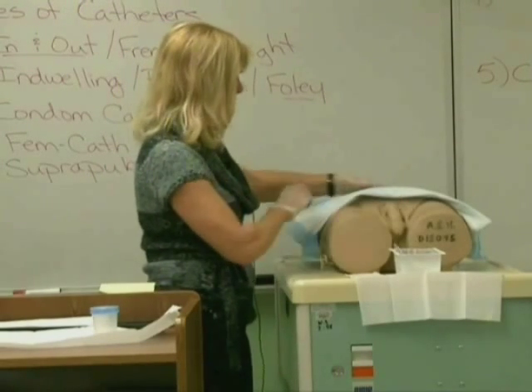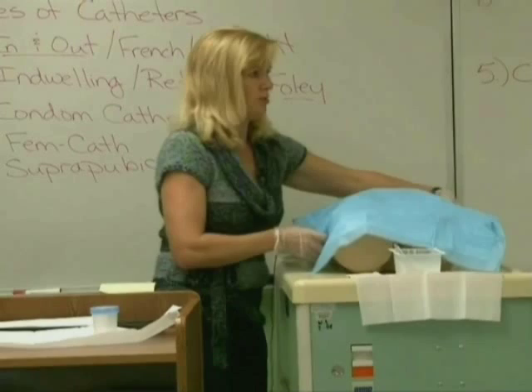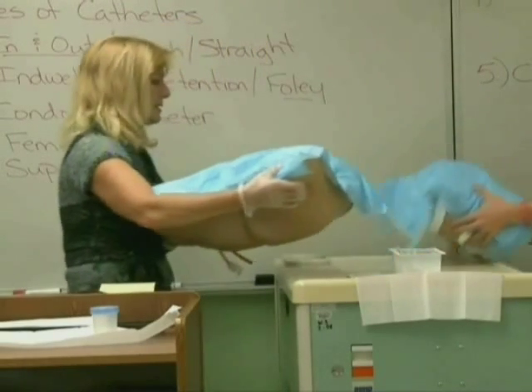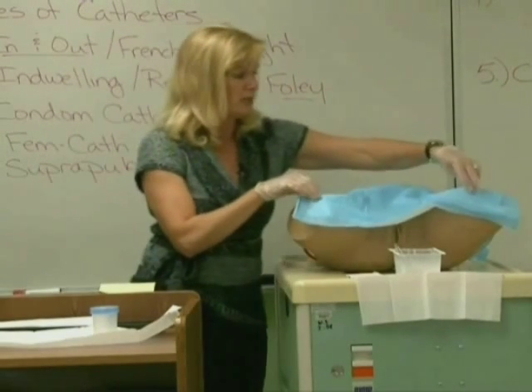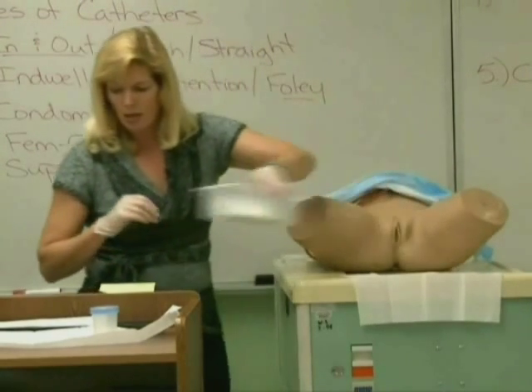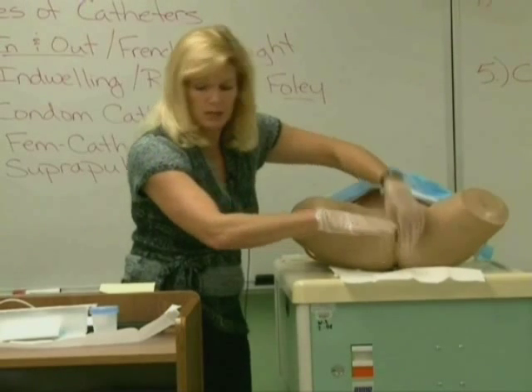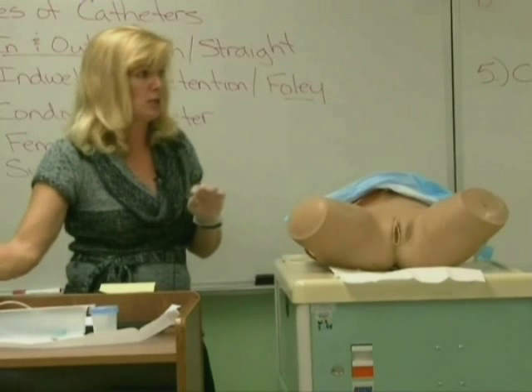Now I'll tell you the differences with the female. Of course, with the female you're going to undrape her before you set up your sterile field. When you set out the drape, the shiny surface goes onto the bed and the absorbent surface goes up. We do not use the fenestrated drape because it gets in the way, so just set it to the side.